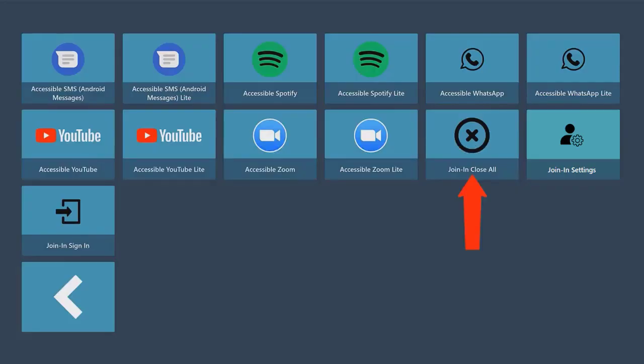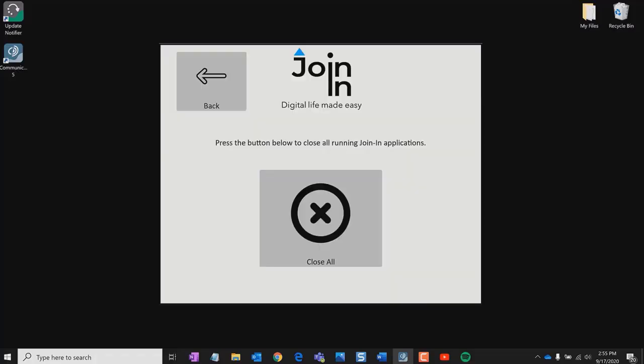Join-in Close All allows you to close all of the accessible apps with windows open on your device.